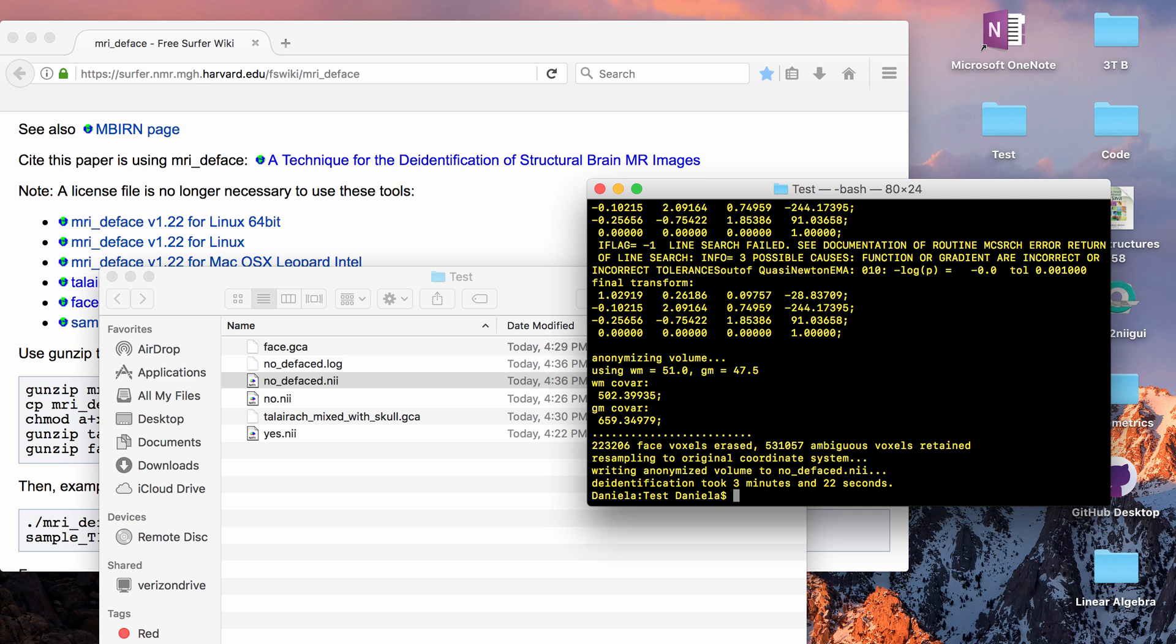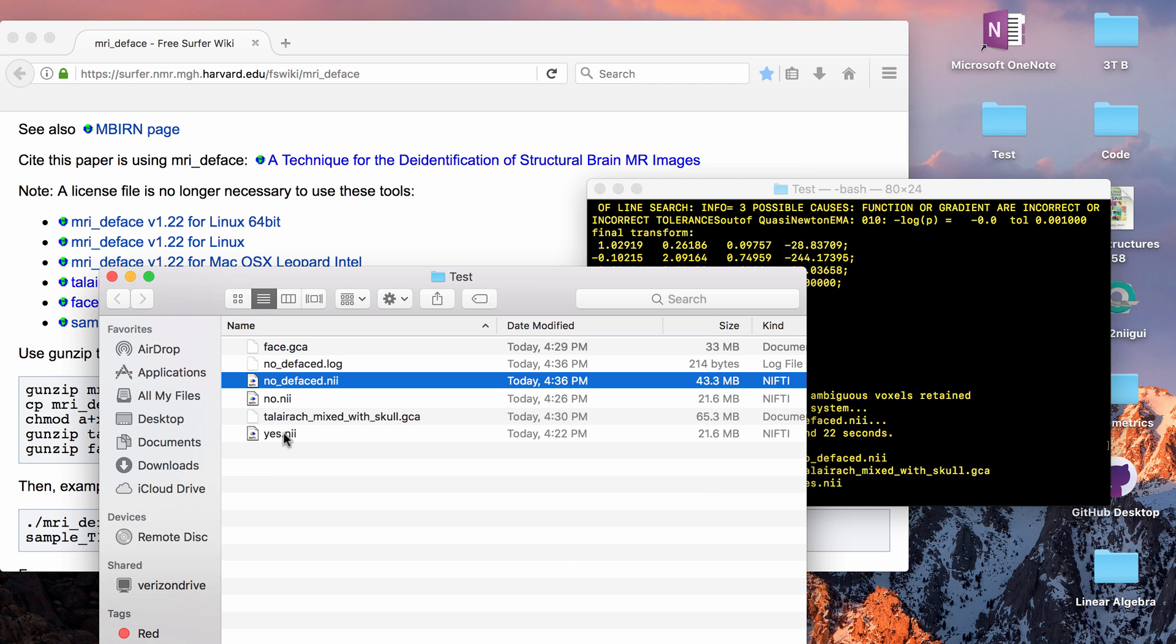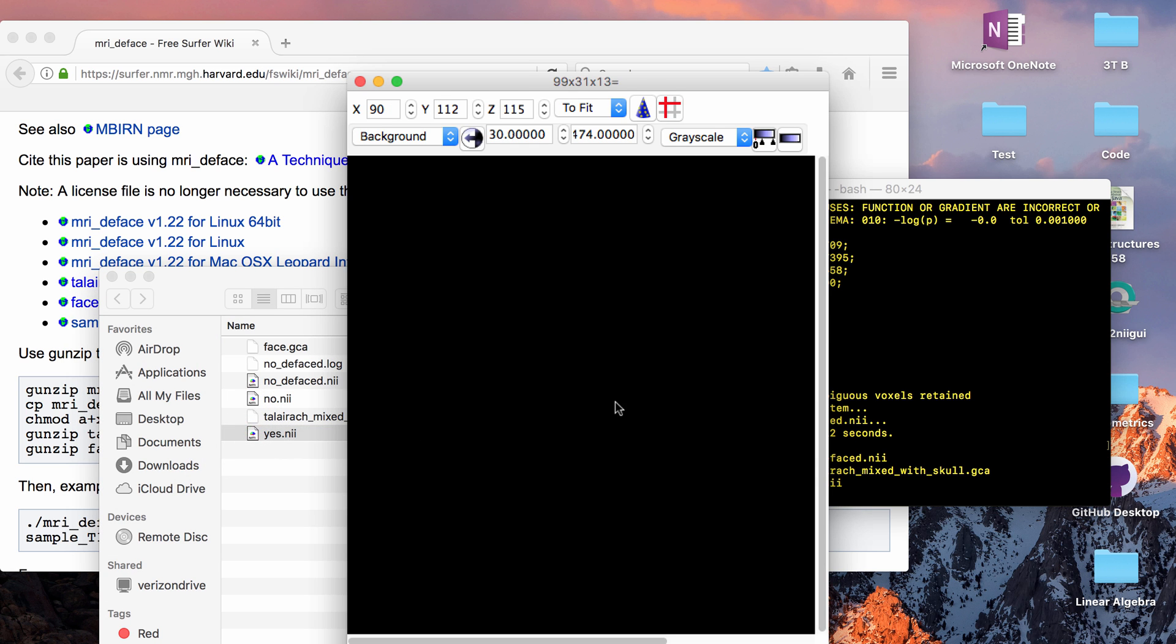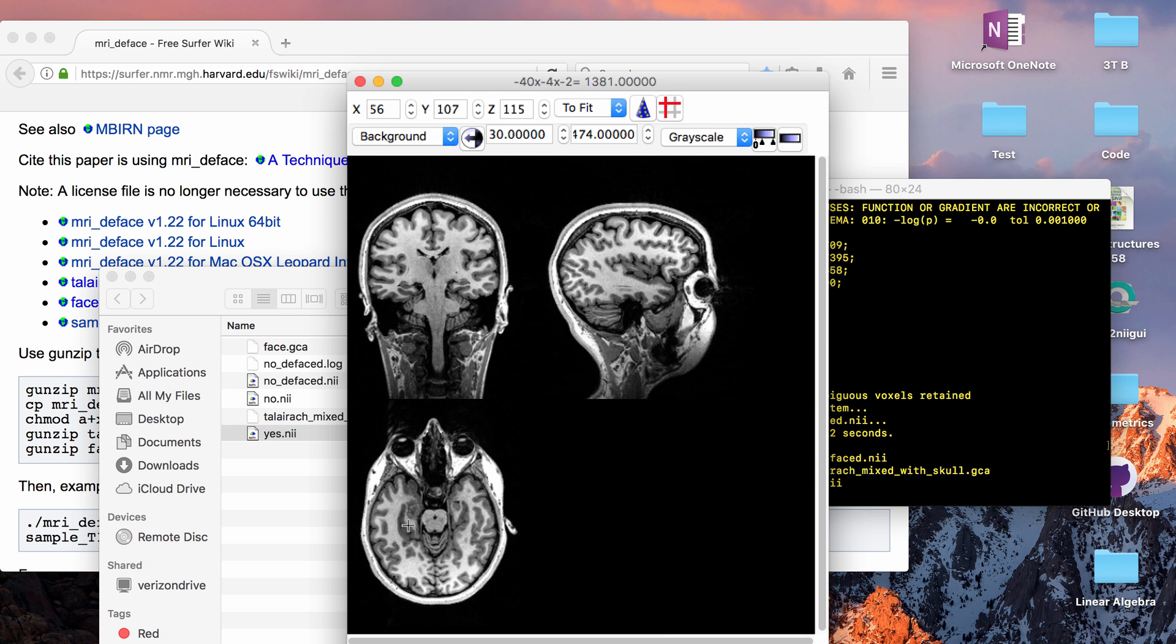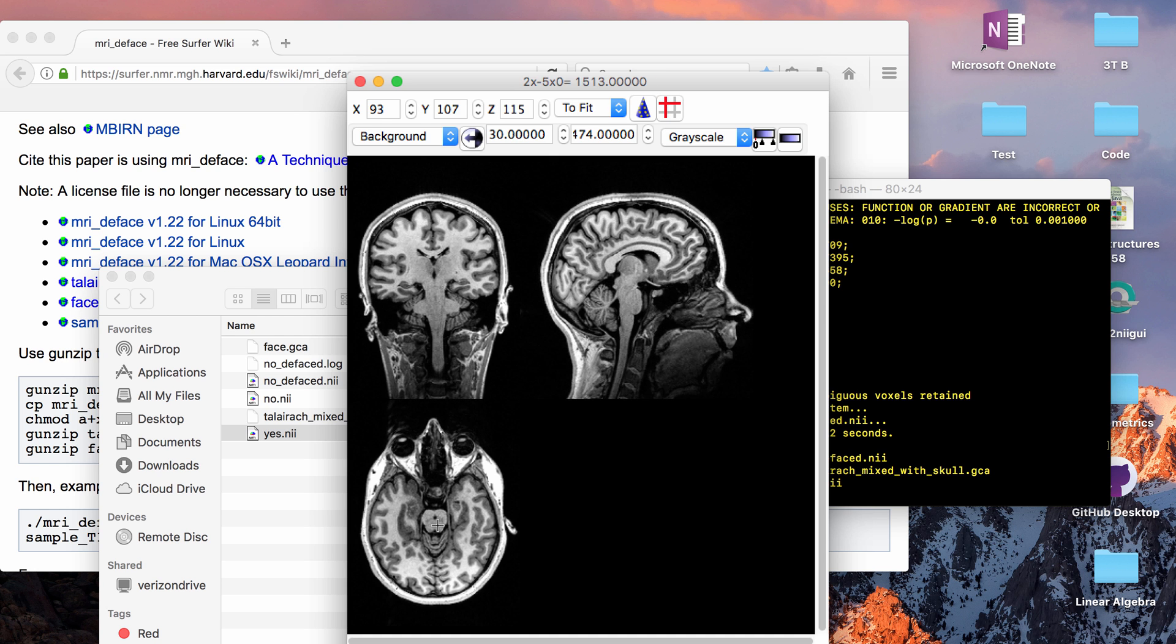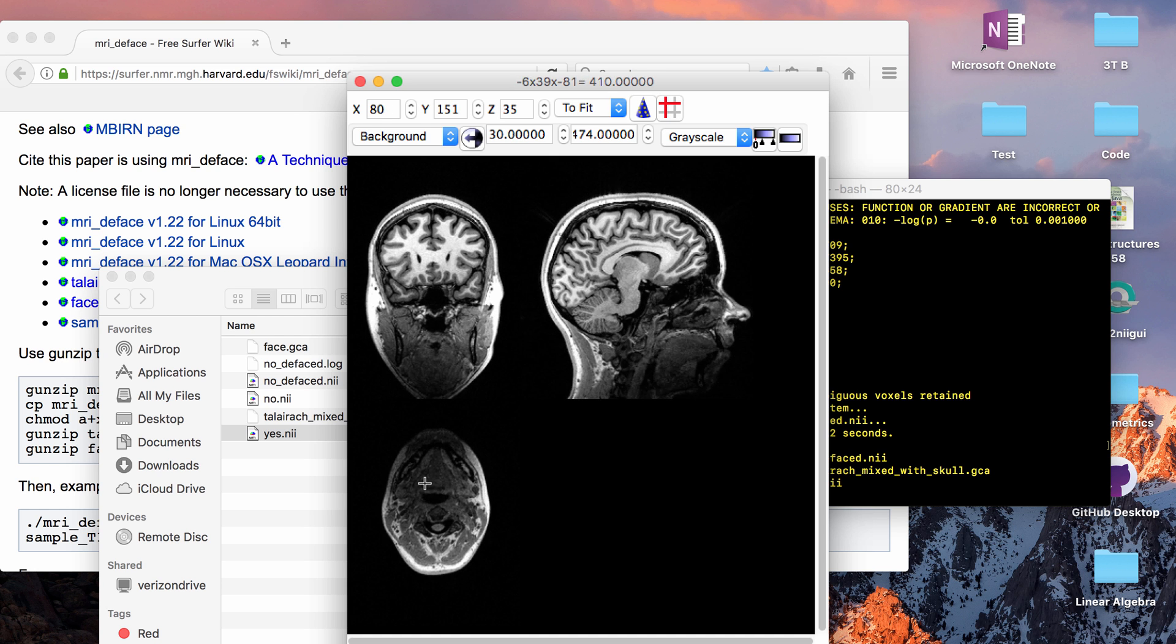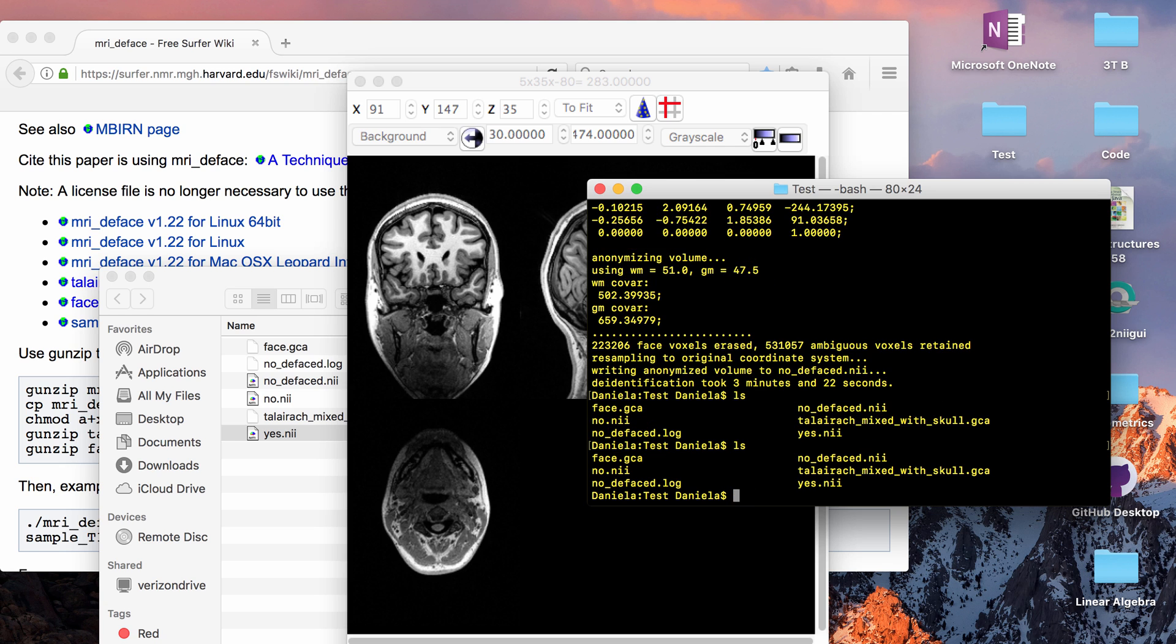So I probably should have started with an example of it working first but I have a file called yes so this is my brain and there's less movement artifact so that might be one reason that it worked better but you can see my nose in this.